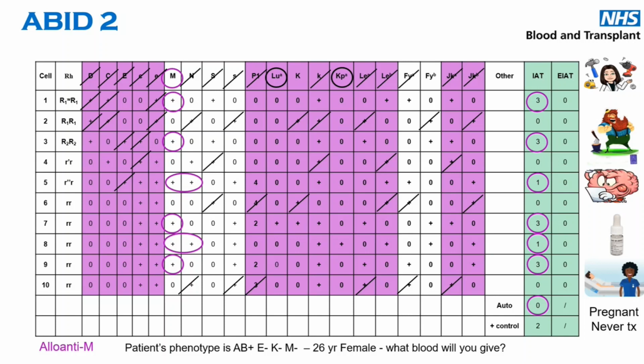Then I've excluded my little s, fab, that's all gone. Excluded big S, great, that one's gone as well. Continue on, move down, that's gone, fab. Now we're getting into the territory where we're like, right, could be an antibody here. So going with anti-N, go down there, got a positive reaction here. It's negative by enzyme IAT, and I'll be thinking, well, anti-M, it's destroyed by enzyme. Then I move on, another one, yep, got that.